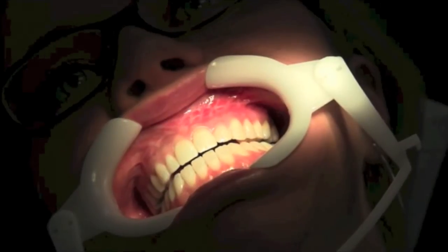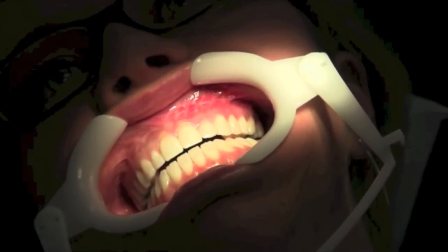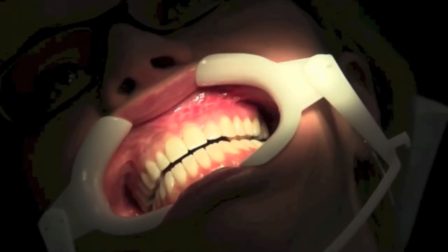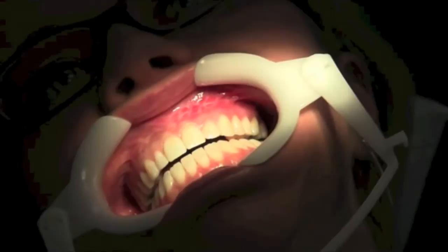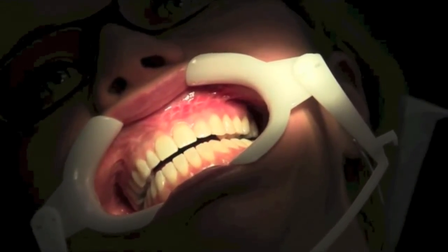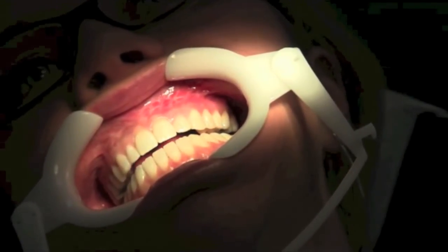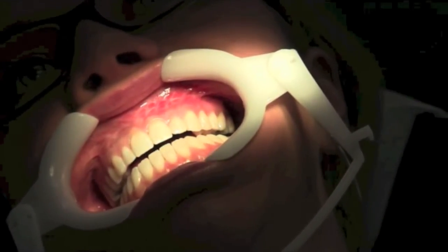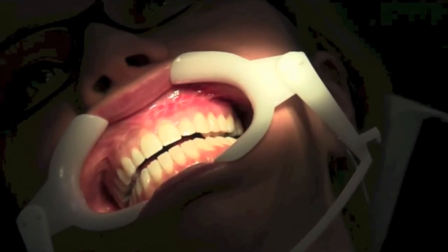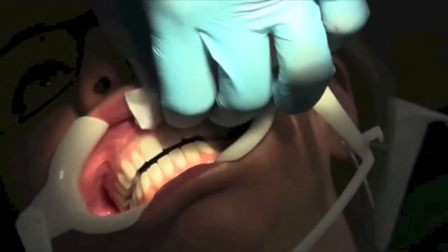The landmark is between the 1 and the 2, or the 2 and the 3, operator preference. It will affect teeth number 1, 2, and 3. A short needle is used. It also affects the lip, vestibular mucosa, and nose. When applying topical, you are going to dry, retract, and place.